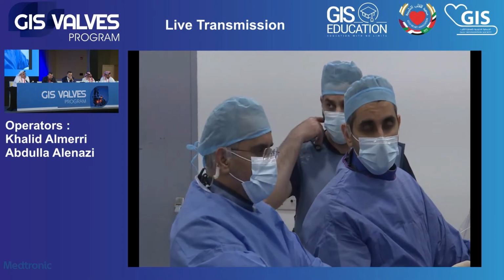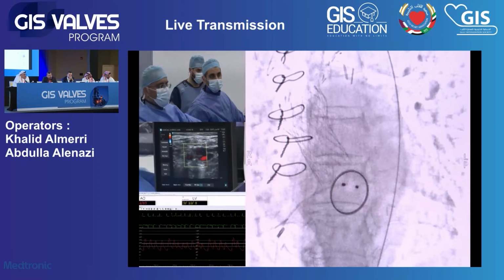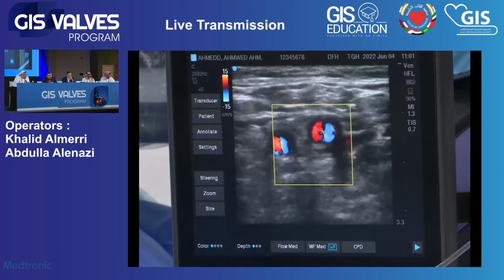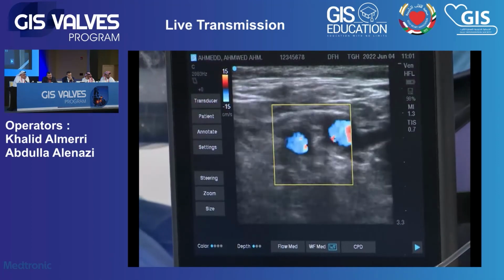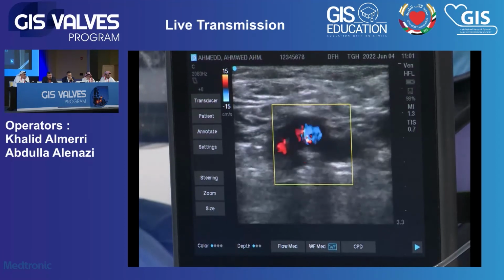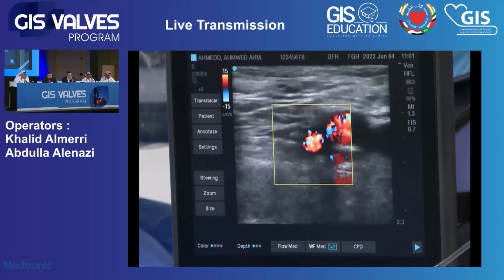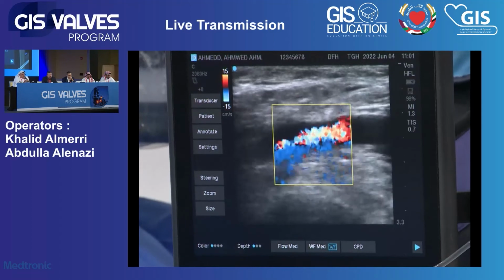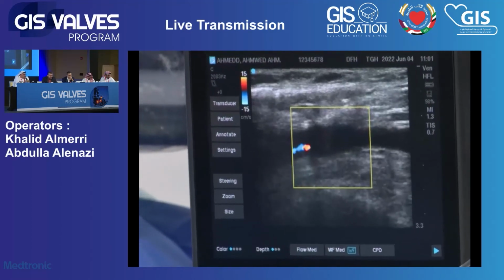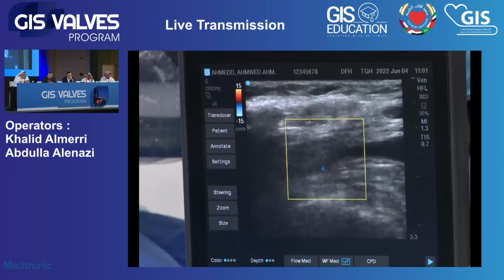I don't know if they can see the ultrasound, but we are imaging. I want to show you, we did ProGlide, and you can see clearly there is a nice femoral artery after the ProGlide, and we don't need to do a peripheral angiography. And Abdullah will do the longitudinal view to show you the flow. Khalid, when you did the puncture, was it ultrasound guided or angiographically guided? How do you usually do that in your practice? I would ask Abdullah to tell you how we usually do this in our center.